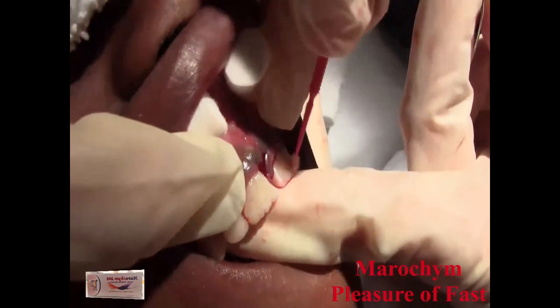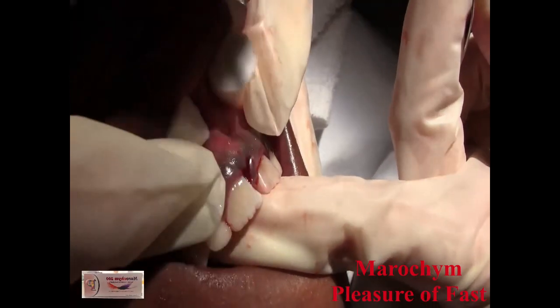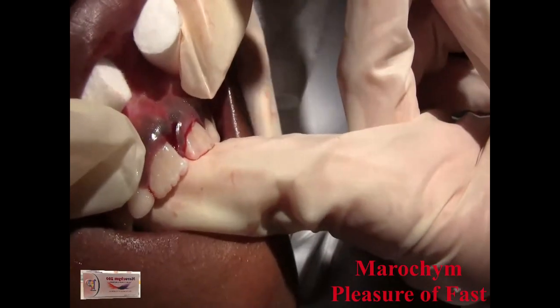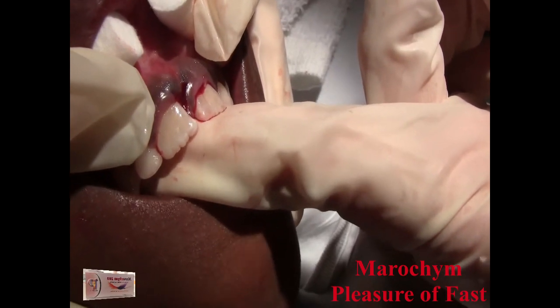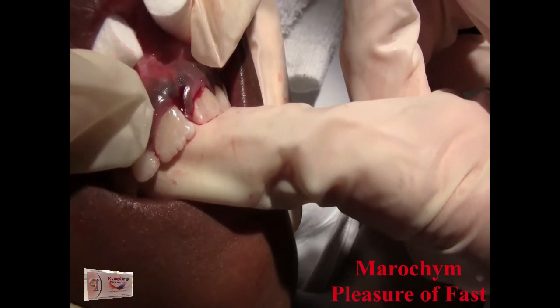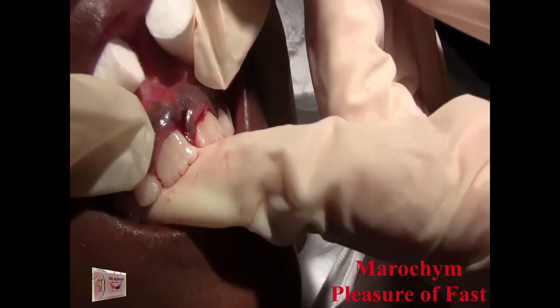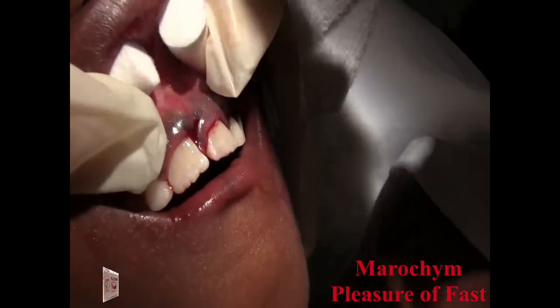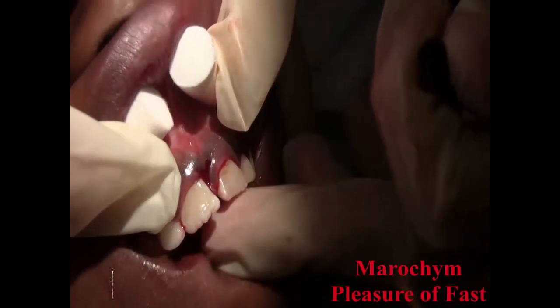Come here. You're going to have to hold somebody's hand for a minute, okay? And actually I'm going to use an extra step in here just to make sure we have plenty of retention. So this is where we're going to use the curing light. Normally you would want to acid etch this and rinse it off and dry it, but we can't do that here. Open big, sweetie.